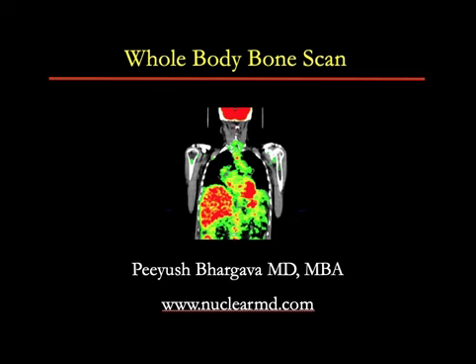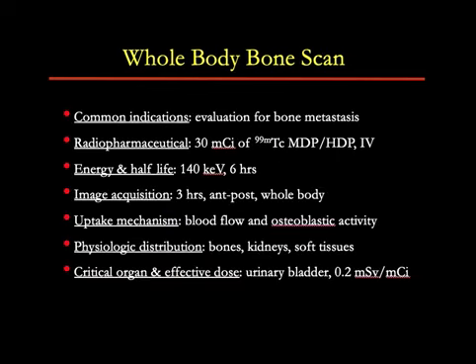Let's quickly review the clinical protocol. Whole body bone scan is performed to evaluate patients suspected of having bone metastases or to follow them up over a period of time after they have received treatment. The radiopharmaceutical used is 30 millicuries of technetium-99m MDP or HDP.